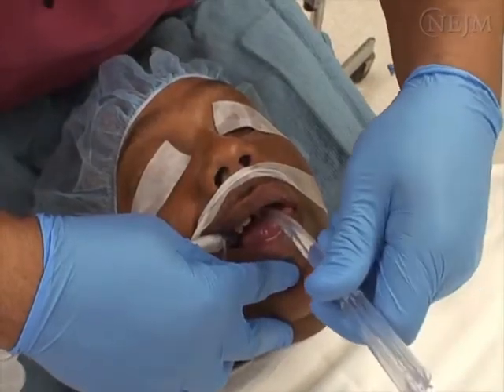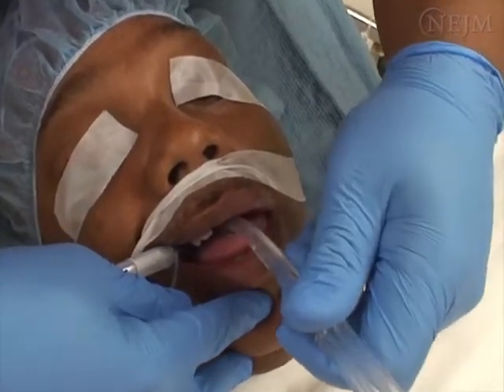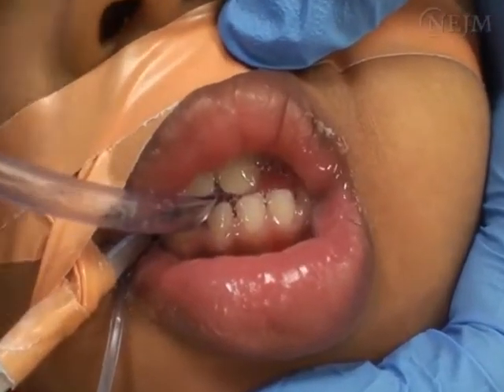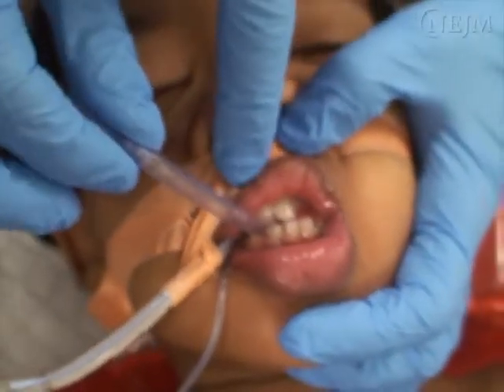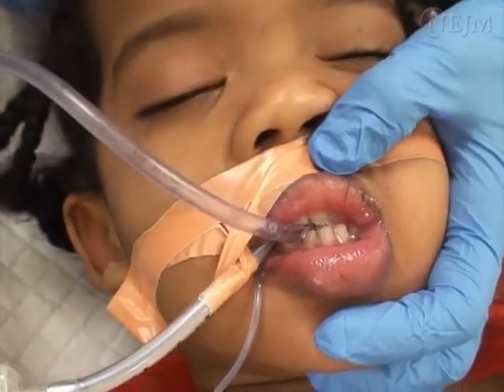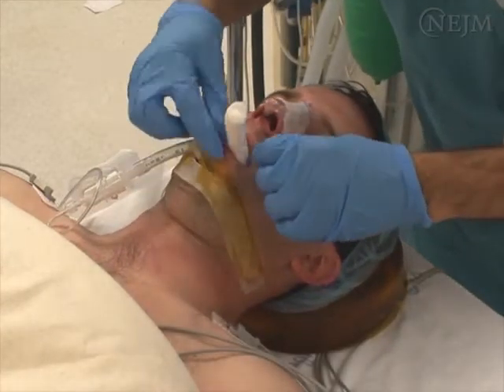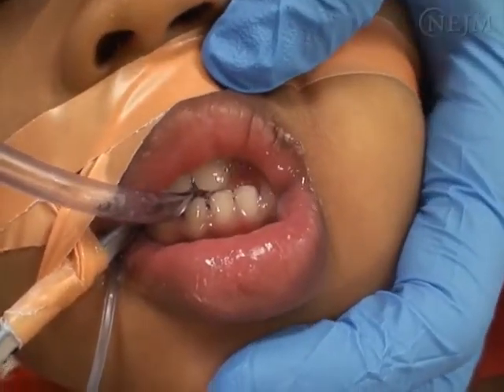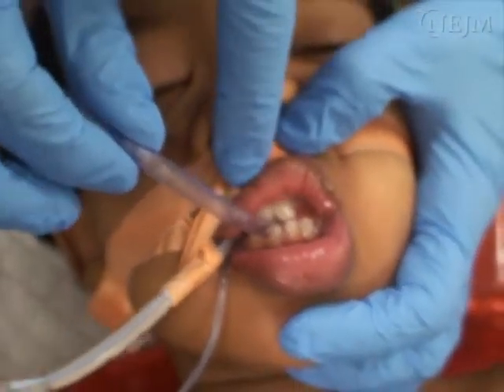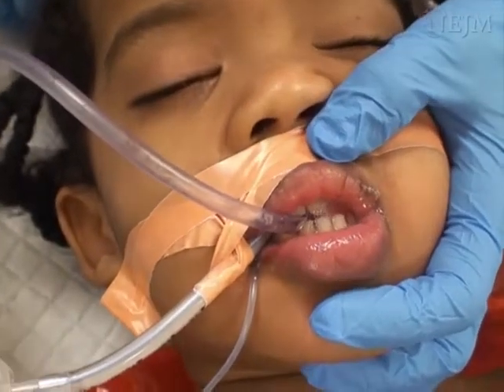A patient with an injury to the cervical spine may require additional neck support. Carefully suction any oropharyngeal secretions, avoiding direct dental or airway trauma. To minimize the risk that the patient will bite the endotracheal tube, which could cause occlusion of the tube or result in dental injury, a bite block or an oral airway can be used. If the endotracheal tube becomes acutely occluded, negative pressure pulmonary edema may develop, in which case the extubation would need to be postponed.